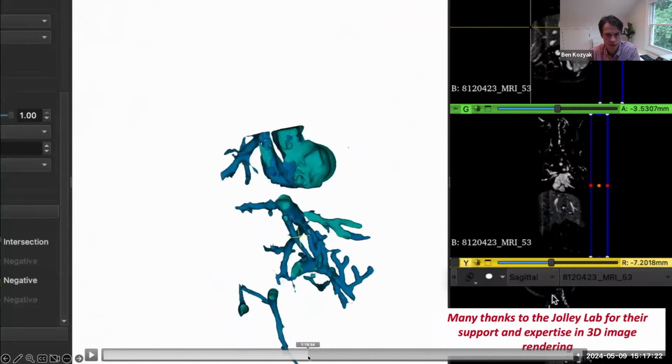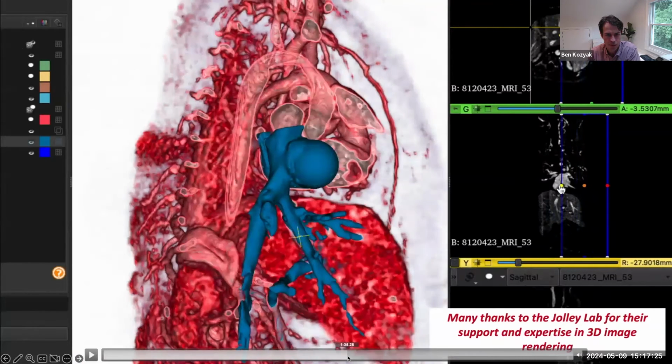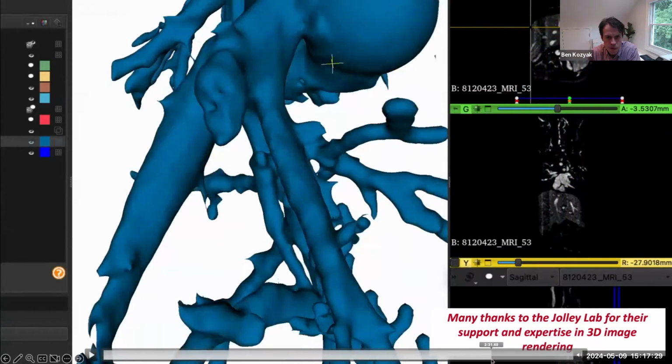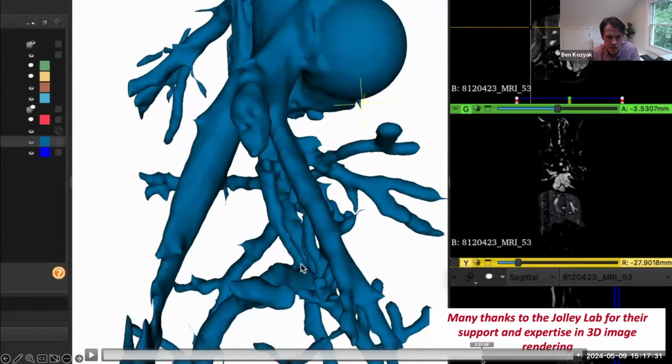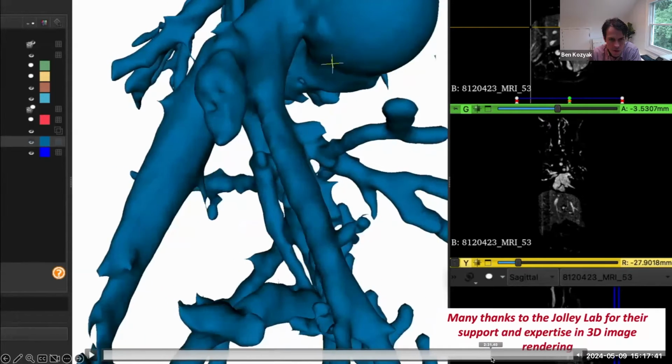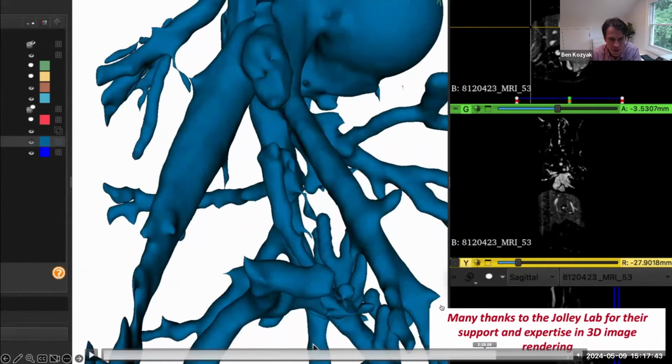take another look at that anatomy. Sorry, let me just go to the end here and where it goes. Okay. So there's that chance. So there's zoomed out the IVC here, hepatic veins here, and here's this channel right here, which I'll zoom in on. That's where you need the catheter to go, right? This guy right in here.